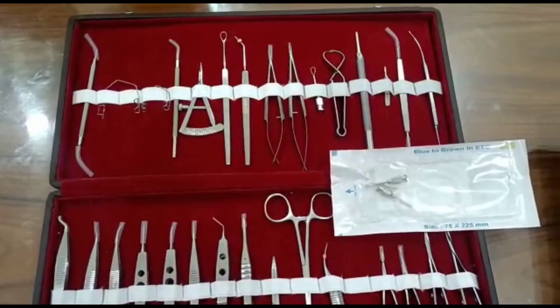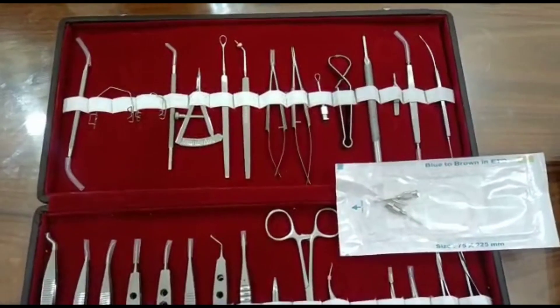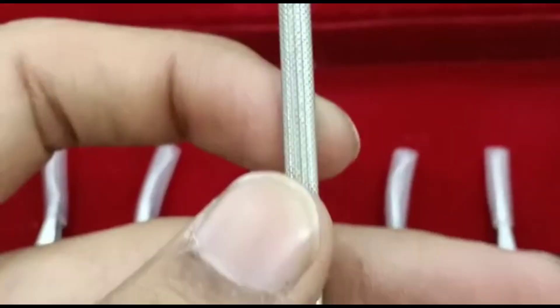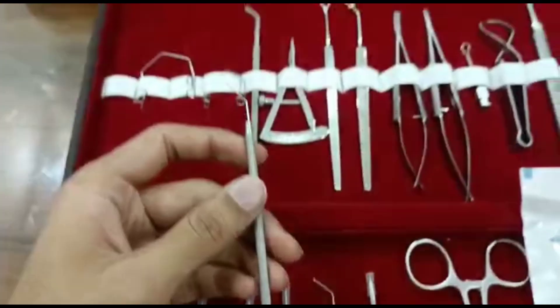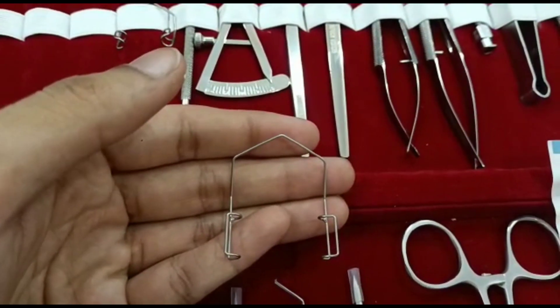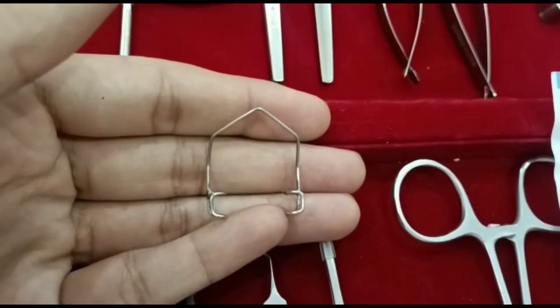Cataract set, 32 piece stainless steel, Mech Unitec Vision. Spatula cum wire rotator, double ended. Wire speculum adult. Wire speculum child.